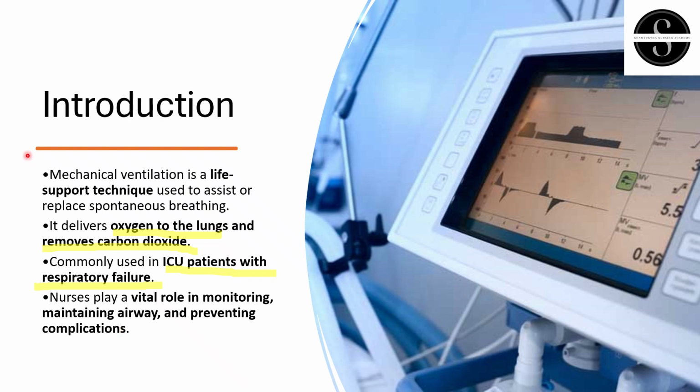Once again I'll repeat, mechanical ventilation is a life support technique used to assist or replace spontaneous breathing. Whenever a patient is unable to take their own breath spontaneously, they need some sort of artificial device called a mechanical ventilator, and ventilation through it is called mechanical ventilation. It delivers oxygen to the lungs and removes carbon dioxide, doing the function of the lungs.